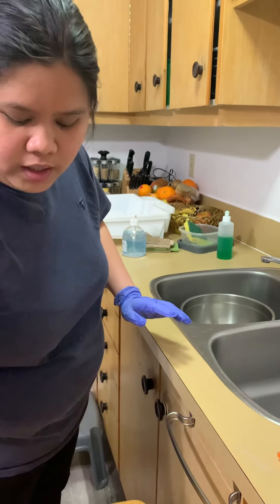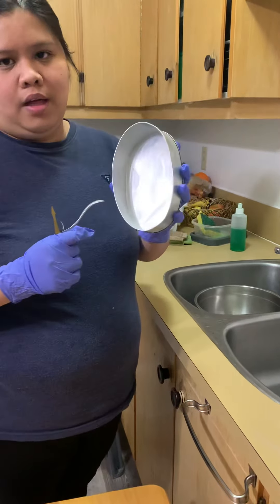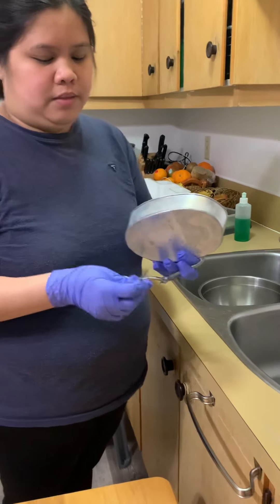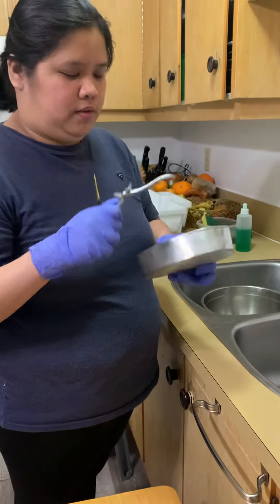I have here — let's assume that these are soiled. This is my kidney basin, this is my scalpel holder, and this is my mosquito clamp.